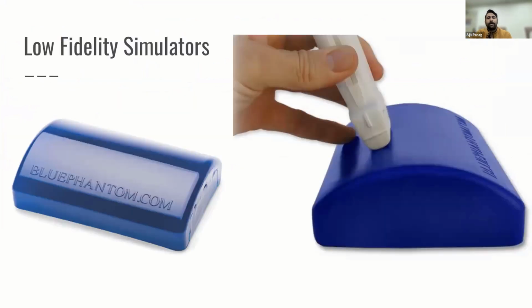The next ultrasound simulation device that has been created, which we've probably all had some experience with or some exposure to at least, is the Blue Phantom. This is known as a low fidelity simulator, basically defined as something that's able to show you some simplified anatomy, usually not more than 1 or 2 vascular structures or nerves. And it's really designed for the user who has some experience already, but wants to put in the reps essentially to get better at, for example, in-plane vascular access.